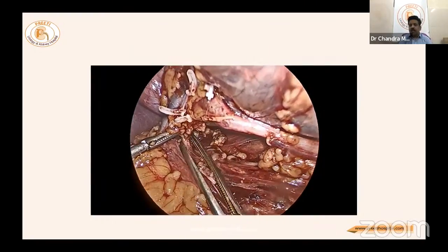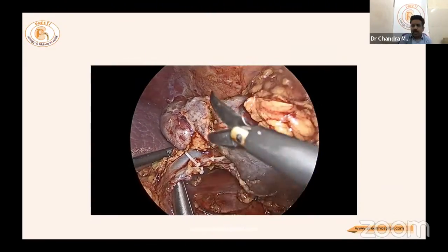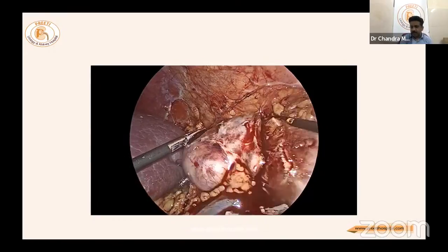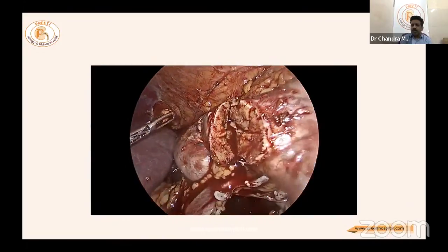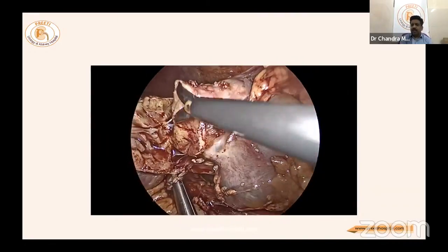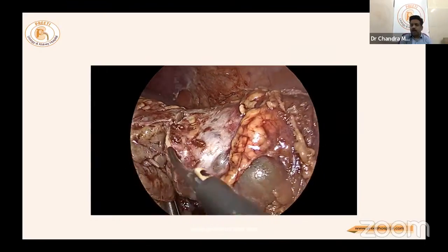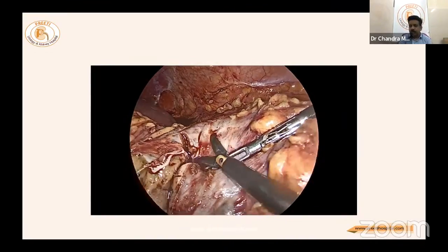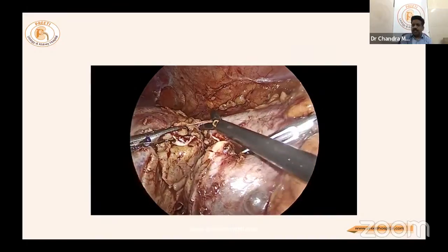After applying the bulldog clamp, cutting begins exactly in the center, leaving the cyst intact. Laparoscopically, the right hand must retract the kidney so the cutting hand can work ergonomically in one plane — otherwise parenchyma is lost or the cyst is opened, defeating the surgical purpose. Posteriorly, parenchyma remains, and the kidney is pulled from the left side — essential in laparoscopy, unlike in robotics.